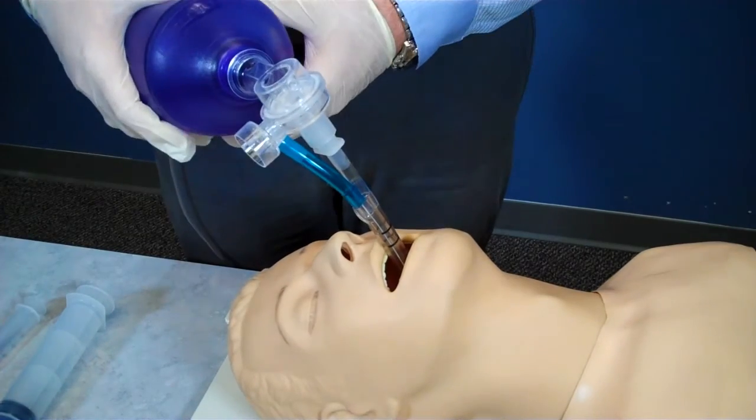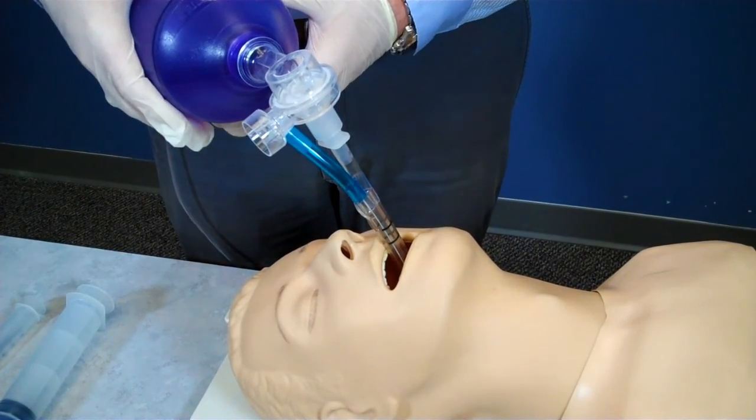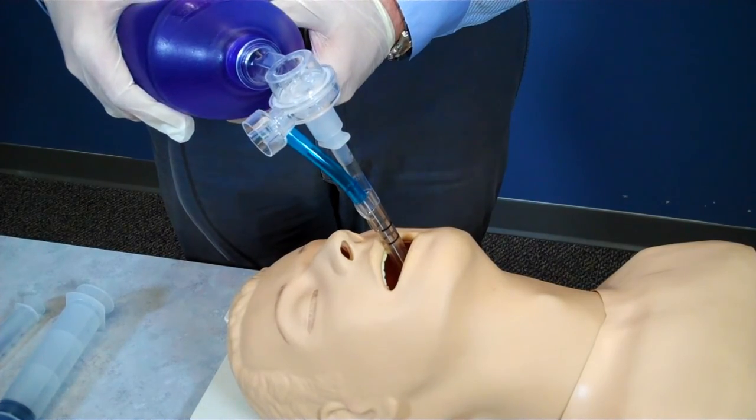I now confirm placement by observing chest rise and auscultating lung sounds bilaterally with no sounds noted over the epigastrum.